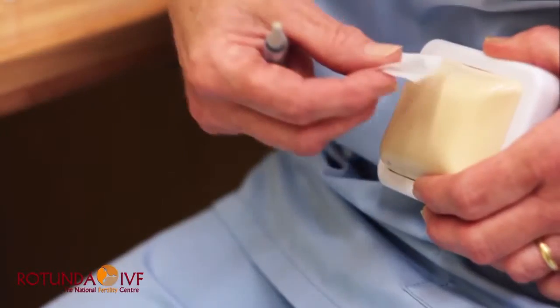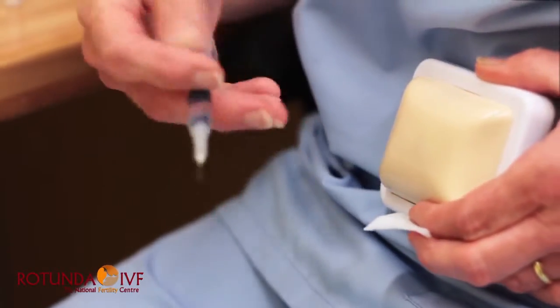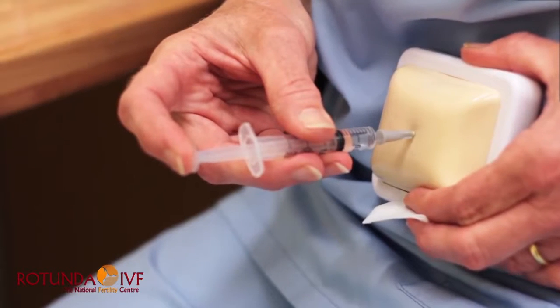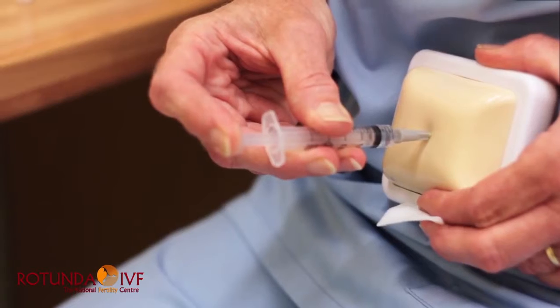The site for injection is in the abdomen. Select one side of the umbilicus. Clean the area with an alcohol wipe just to get rid of any surface bacteria. Insert the needle fully into the skin and depress the plunger steadily until you've given all of the Pregnyl injection.